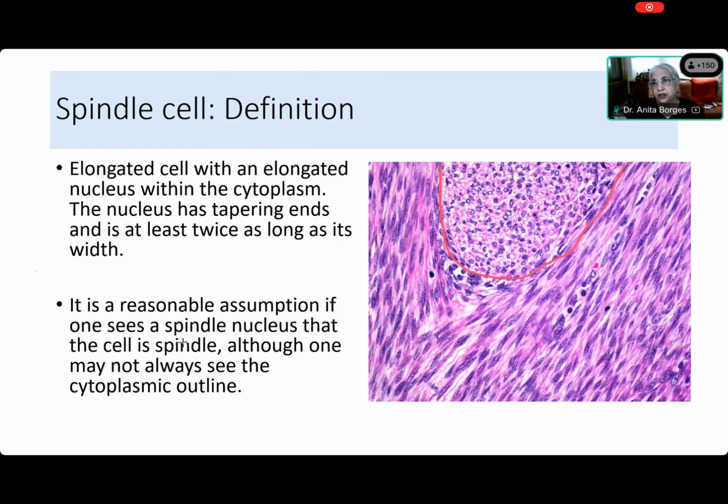So what is a polygon? You had a nice lecture on polygonal cells. So why do you call these polygonal? Yeah, ma'am. They're not, right? And really, you're not talking about the cells, Shashank. You were talking about the nucleus. Am I right? Yes, ma'am. All right. So now you tell me, what is this that you are seeing in this otherwise spindle cell lesion?